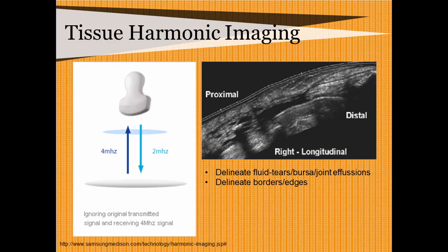Now, unfortunately, every beneficial effect of new technology is accompanied by a few disadvantages. So tissue harmonics is not exempt from this. There are two main disadvantages. First of all, the depth of penetration suffers.